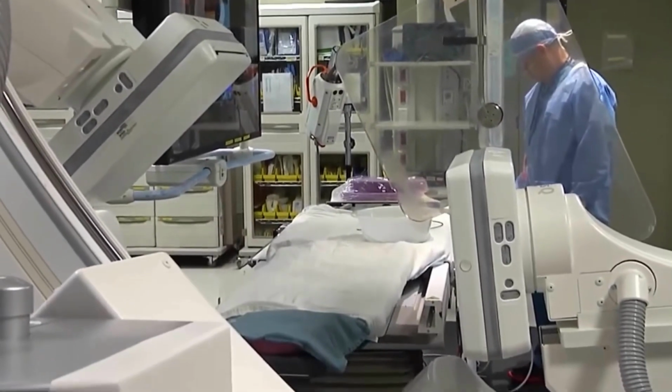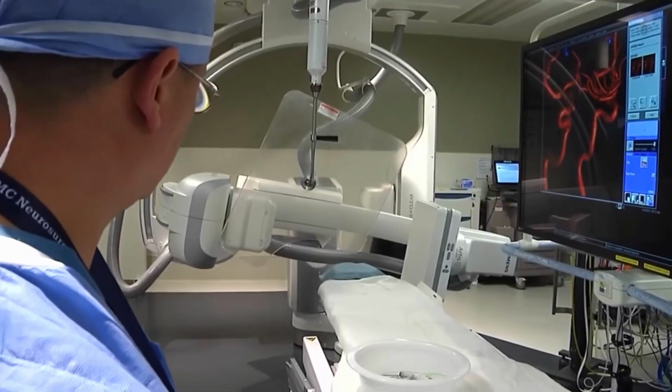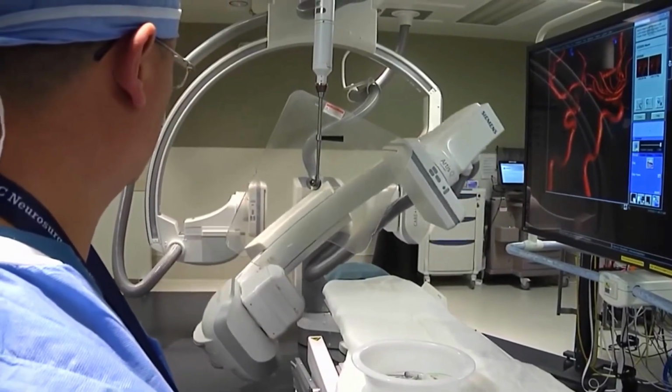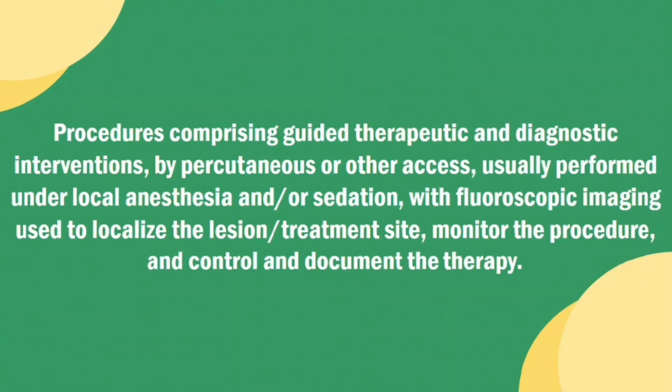The use of fluoroscopically guided interventional procedures can be conveniently defined as the procedures comprising guided therapeutic and diagnostic interventions by percutaneous or other access, usually performed under local anesthesia and/or sedation, with fluoroscopic imaging used to localize the lesion or treatment site, monitor the procedure, and control and document the therapy.